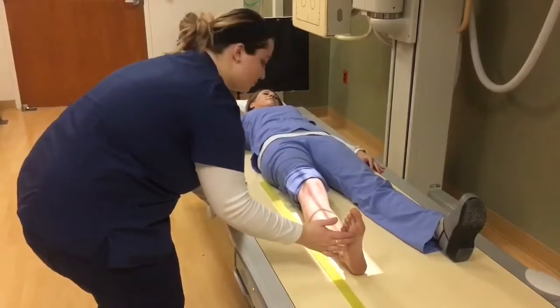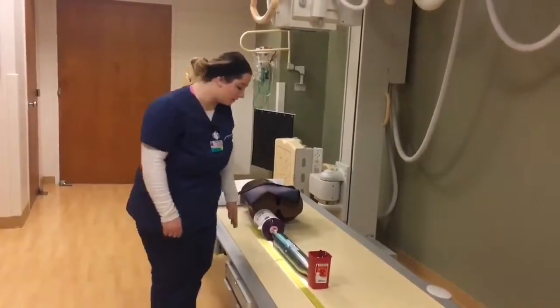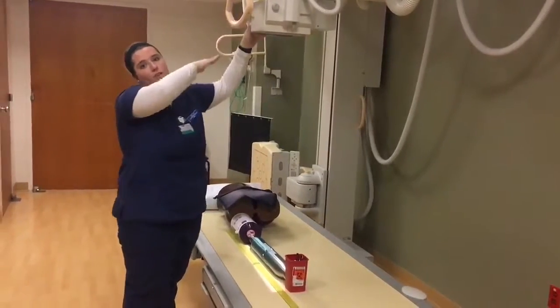Shannon, could you flex your toes towards the sky? Great. We've made sure that our part is straight, but we also have to make sure that our ruler is straight as well. Also, we can't angle our collimator box or else the machine will not stitch the image.